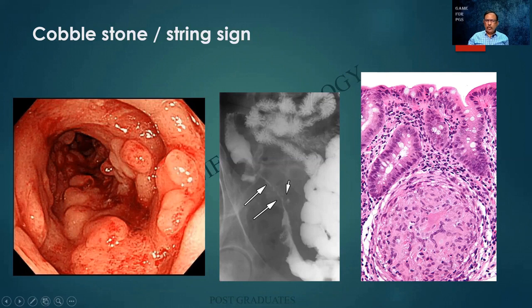And classically, when you go lower down, you are supposed to look for the granuloma. Granulomata will be present. There are other abnormalities that I have covered elsewhere, and people can also be reading up in the inflammatory bowel diseases. But then there is one. Once you get a granuloma, what is your diagnosis?